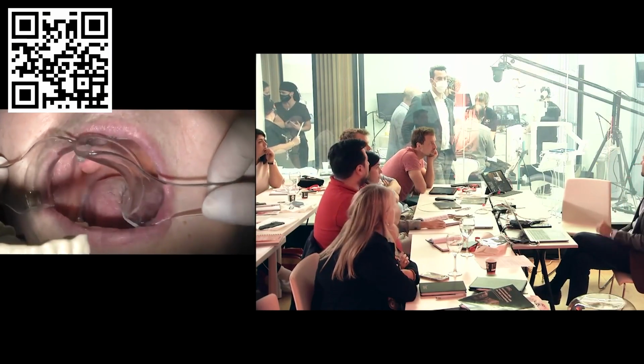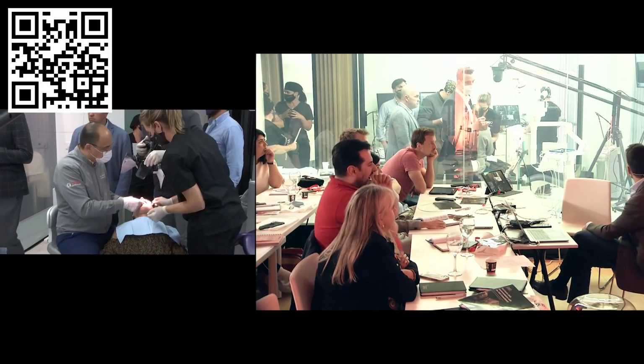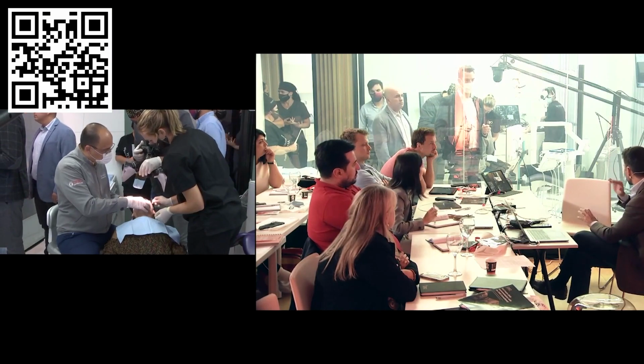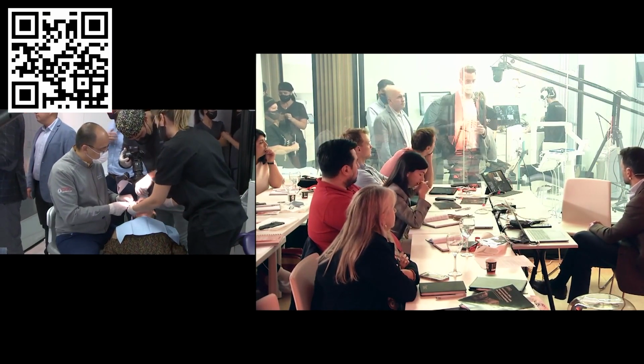Christian, we're going to pretend now that the passivity test is not good. So imagine, how is the bite and the aesthetics? We took facial photos, and Jesus is going to show the facial photos now. It's good.